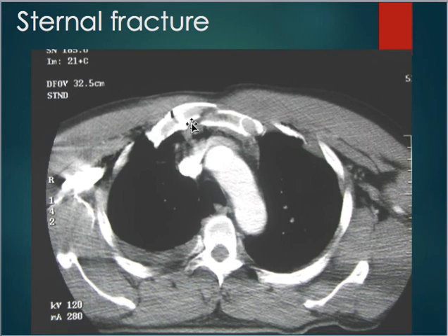This is a sternal fracture, most likely due to an MVA. So you can see the difference here where it's fractured. A sternum is a very spongy bone, so you can see here it's less dense in the middle. A lot of times in MVAs, patients that have their seatbelt on, they'll get a sternal fracture because it lies right under the seatbelt.